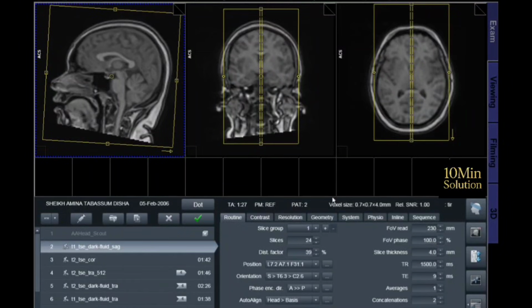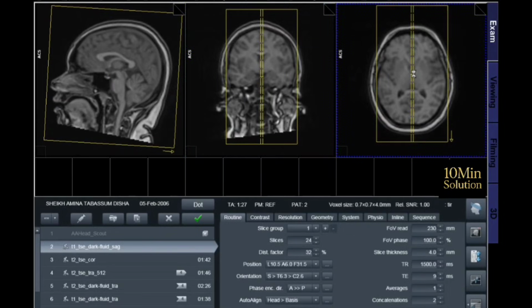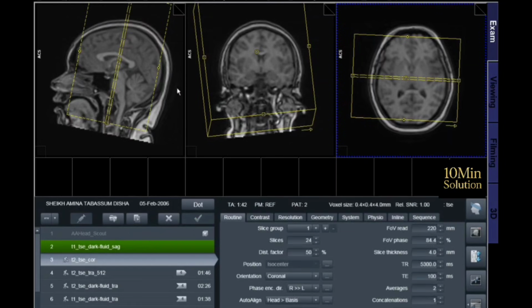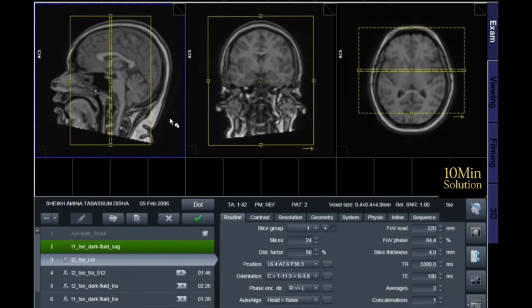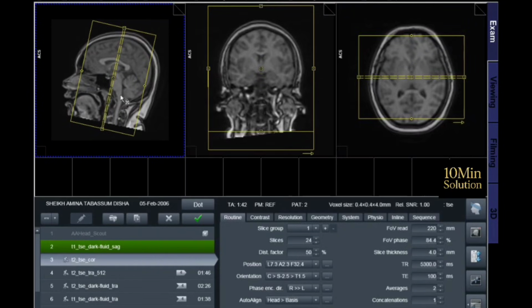In today's video, we will discuss the MRI brain and orbit planning protocol. Proper planning is the most critical step in MRI of the brain and orbit. Even a small planning error can significantly affect image quality and may lead to missed pathology. The brain and orbit are highly sensitive anatomical regions. Therefore, high-resolution imaging, thin slice thickness, and accurate plane selection are essential for optimal evaluation.